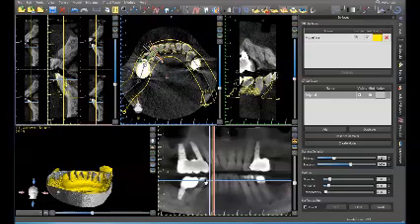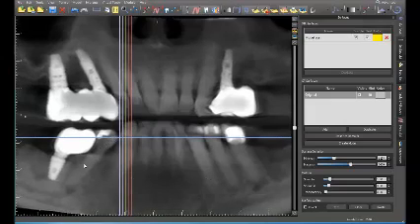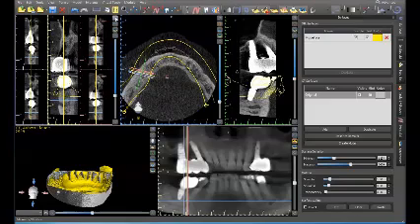So the idea is to place an implant here in this area. You can see the angle of the current tooth. So we had to place this implant at an angle, and I wanted this cantilever effect. So what I'd like to do is, now this tooth has a decay below the bone, I'm going to place an implant here and then eventually convert this to a 3-unit bridge, or maybe even fixate these 2 teeth. We have a couple different options because I don't like that cantilever. He's doing a good job of keeping it clean.